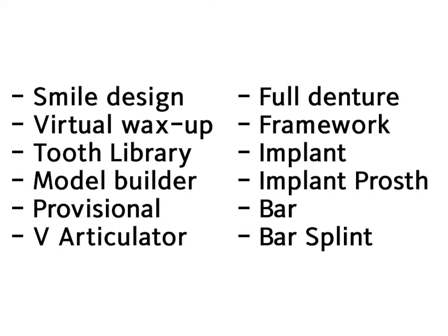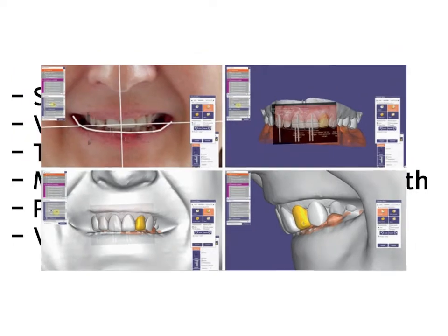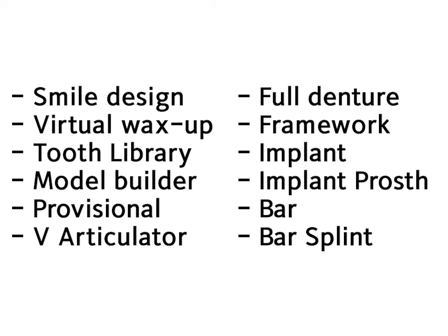The first one is Smile Design. As described earlier, Smile Design software can process 2D photos and/or 3D files of the patient face and teeth. It could also merge intraoral scans with the facial scans for more comprehensive results. With this module, the dental care provider can edit reference points and lines in order to determine the ideal dental proportions and select teeth from an electronic library to simulate the final results of the proposed treatment.